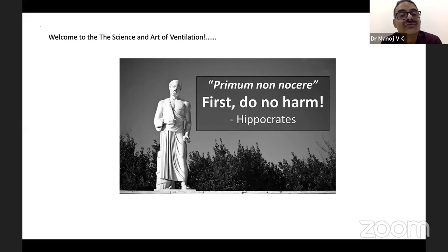So you use more baby-friendly modes, and you use them in such a way that you give maximum guidance but let the baby do its own work. So aim for PSV. Most of the time PSV mode will not work, so go for the next best, assist control, because until the baby's brain is okay and the baby does not have physiologic tachypnea and all, PSV mode may not be a good option.